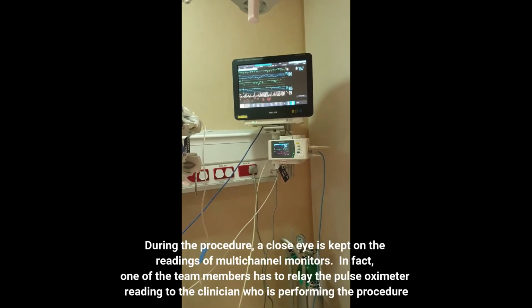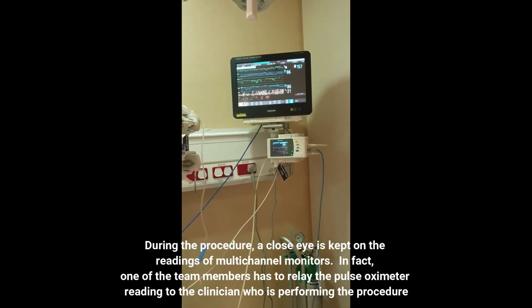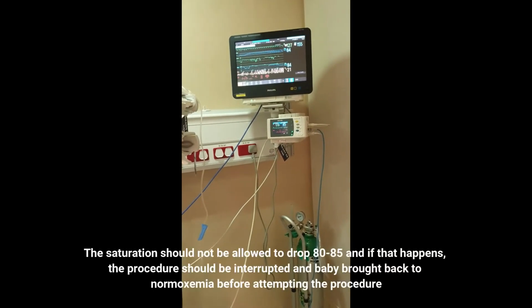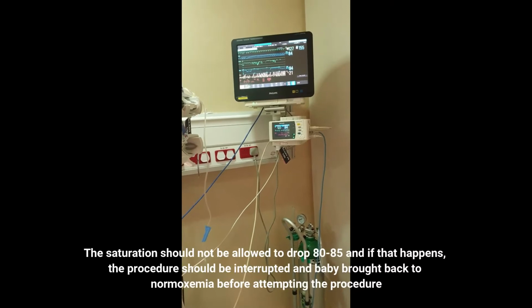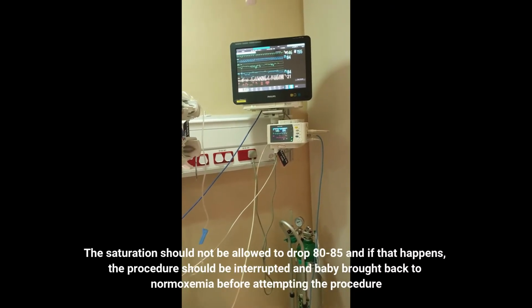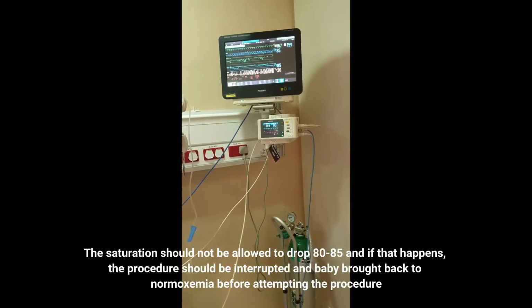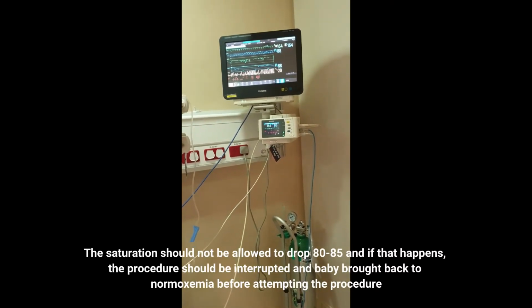In fact, one of the team members has to relay the pulse oximeter reading to the clinician who is performing the procedure. In this situation, it's me. The saturation should not be allowed to drop below 80 to 85, and if that happens, the procedure should be interrupted and the baby brought back to normoxemia before attempting the procedure again.